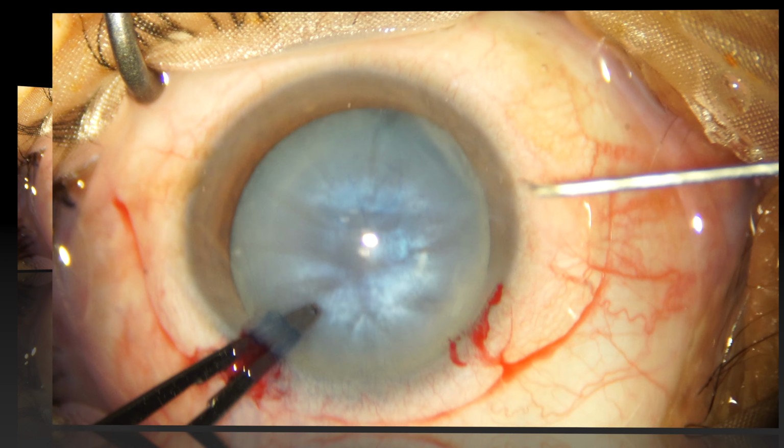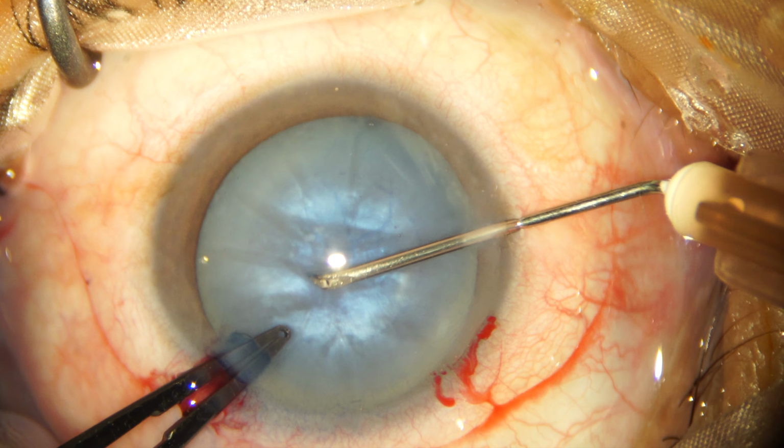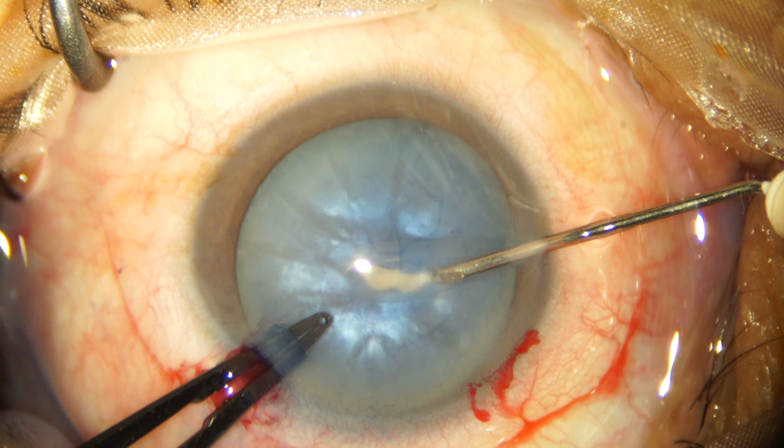So after making a triplanar 2.8mm incision, we are now initiating the capsulorhexis with a 26 gauge bent cystitome.